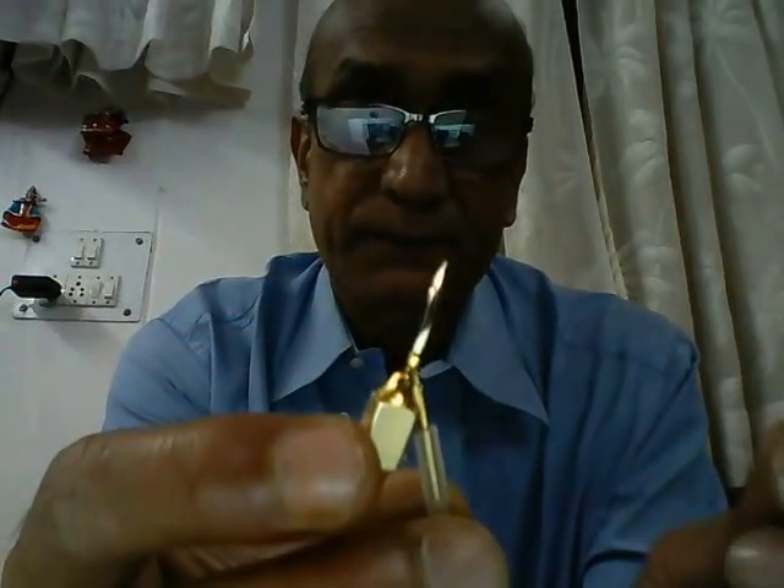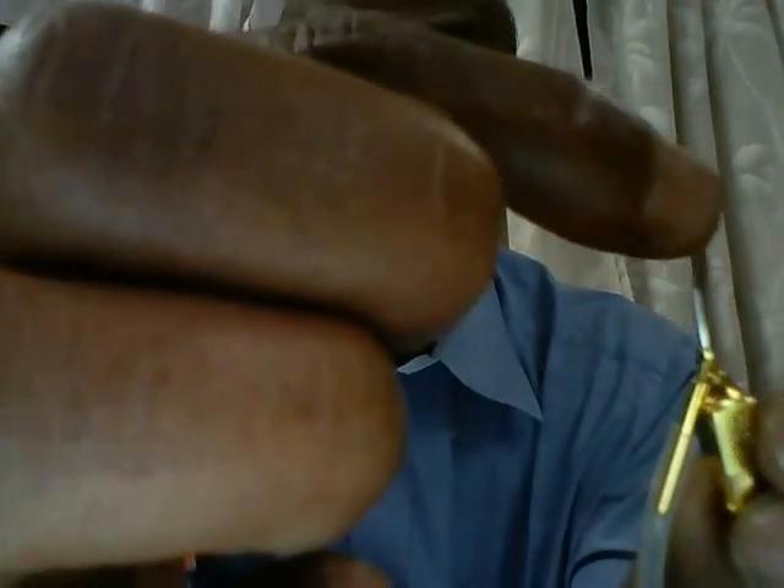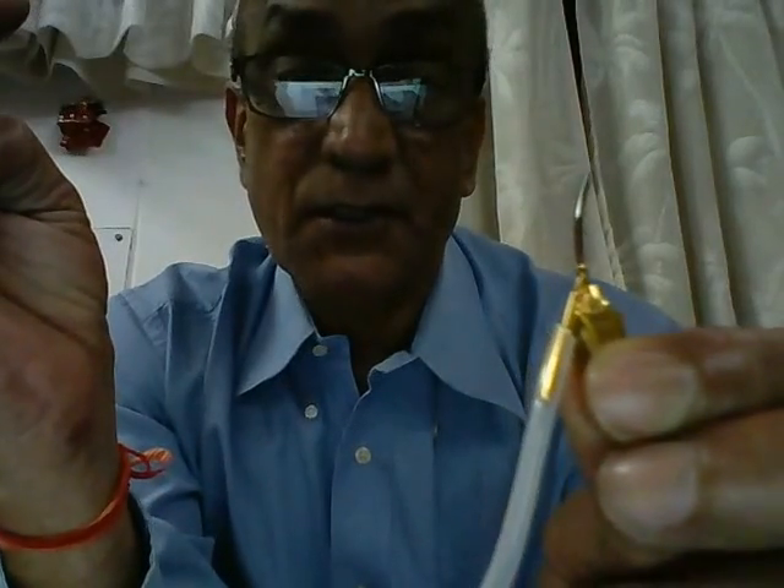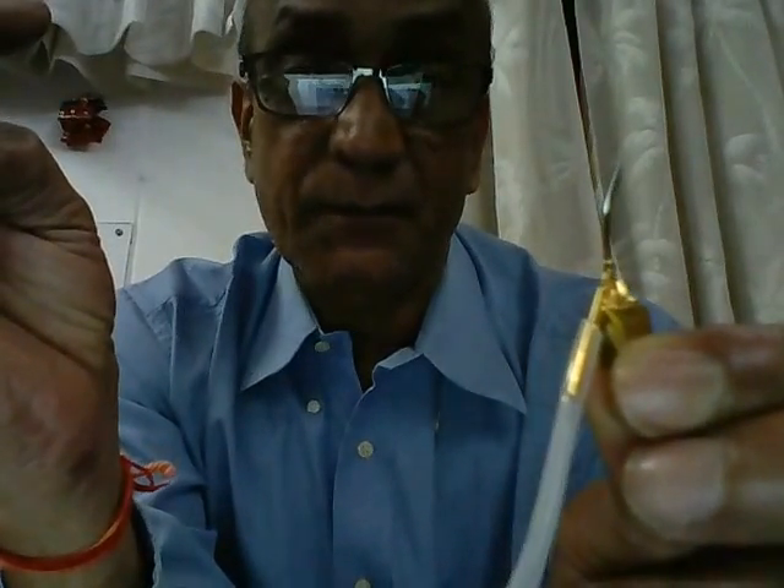If you take a look at this tip here, you will find that there is a small opening right at the tip — this is known as the anterior port. There's another opening on the side here, this is known as the side port. The anterior port is always meant for suction or aspiration from the anterior chamber, and the side port is always meant for irrigating the anterior chamber.